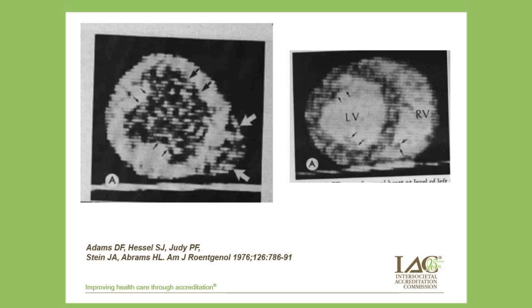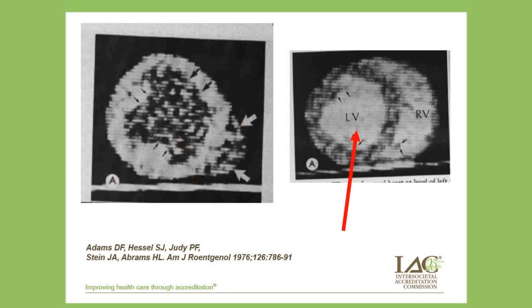Here are very early CT images published in 1976, almost 40 years ago, obtained by scanning excised heart specimens. Notice the extreme pixelation and limited detail. Notice the low cavity attenuation against the much higher attenuation of the non-enhanced myocardium. The specimen on our right was filled with contrast material before scanning, giving high attenuation of the cavity of the left and right ventricular chambers.